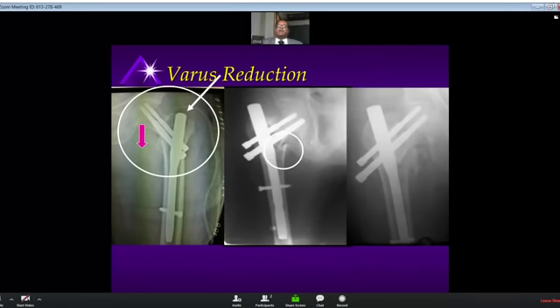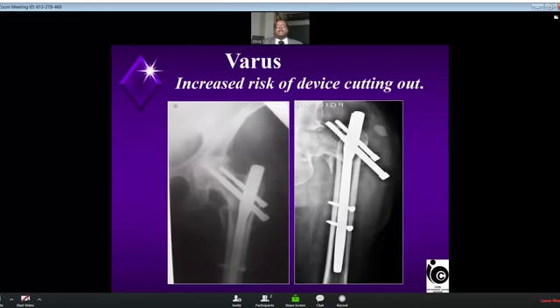Recently, a beautiful terminology has been coined for this. It is called a negative cortical contact. I will come to that a little later. Another case, the same case on the left, which has gone into Z effect in due course of time after the beak has collapsed and is touching the nail.